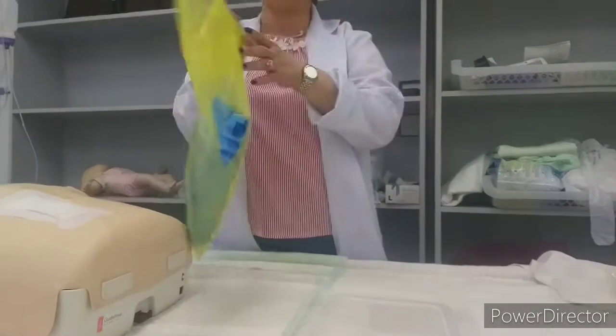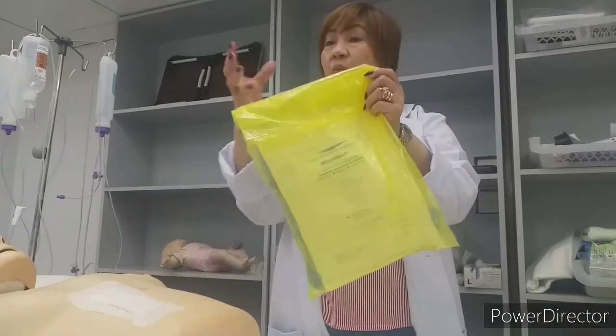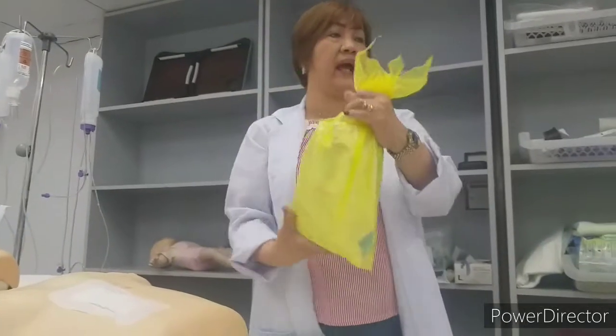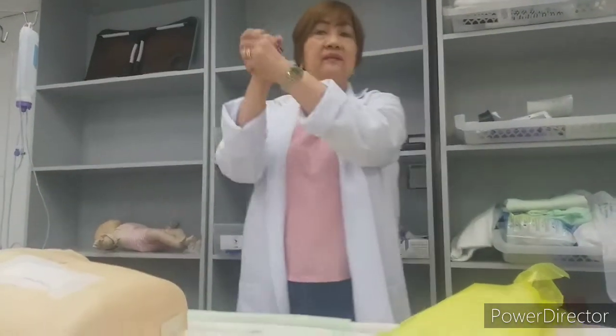Okay, so there is a seal here. You can seal it. Or actually it comes with a wire. So with the wire, tie it and dispose it to the medical waste. Come back to the patient, hand hygiene, hand washing, hand sanitizing. Come back to the patient, keep the patient comfortable, and document.